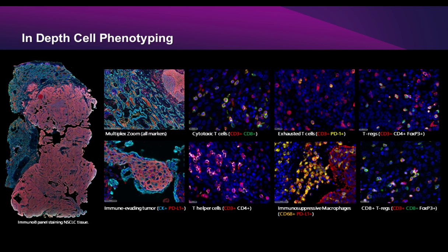I apologize. No problem. Now, different antibodies might have different affinities, so should we perform different antigen retrieval protocols at the same time for multi-staining? So, here at Ultivue, we make sure we optimize all our antibodies for a pH 9 antigen retrieval, or ER2 on the Bond. And we haven't come across anything yet that has required variant ways of doing antigen retrieval, like a pH 6 or something like that. Most good high-performance antibodies that are on the market today are usually amenable to using a pH 9 antigen retrieval. So we've been able to standardize quite regularly on that.